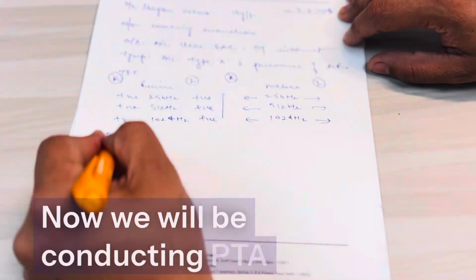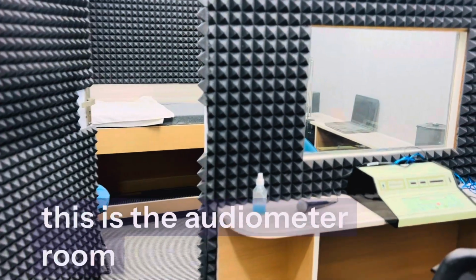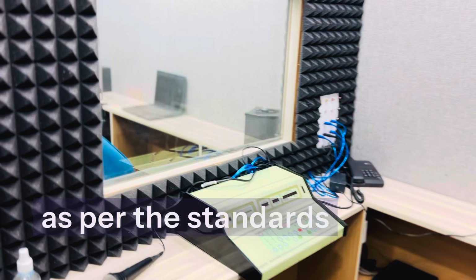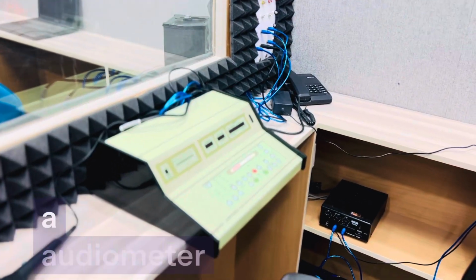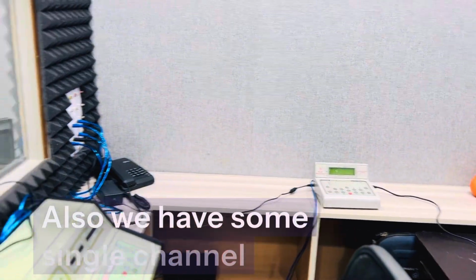Now we will be conducting PTA, and we have a separate audiogram, but again I am going to write it. So let's go for the PTA. This is the audiometry room, which is a sound treated room as per the standards. So I have an audiometer, which is a diagnostic 2-channel audiometer. Also we have some single channel audiometers.